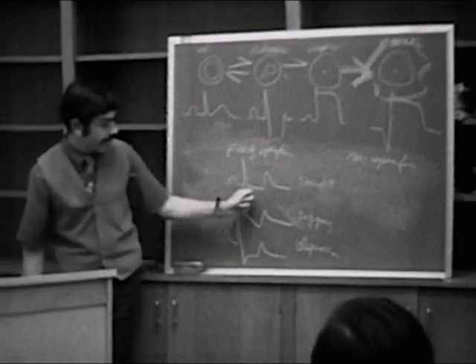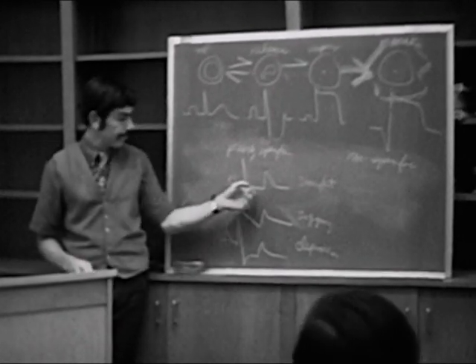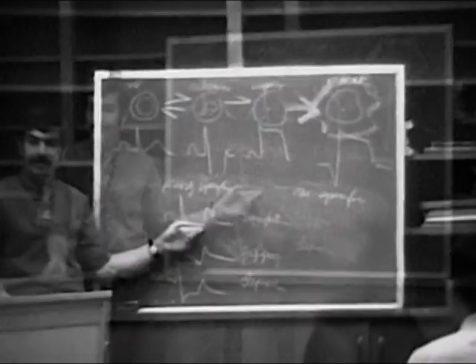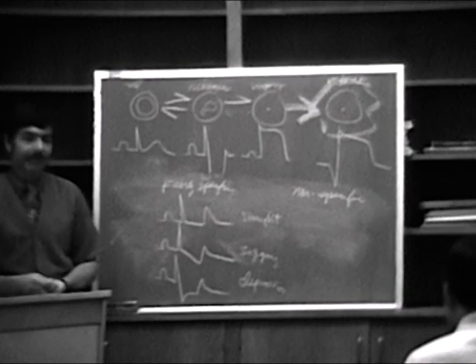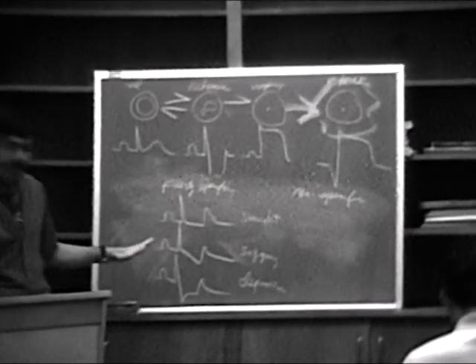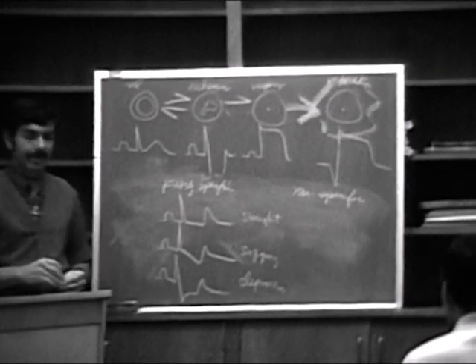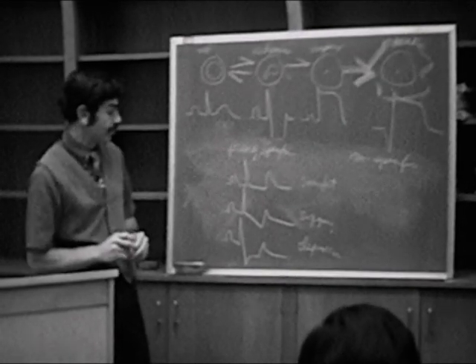Now, in the beginning, before you have much practice in looking at this, you tend to first ignore all of these, and then you tend to overread them all, and finally, after a fair amount of practice, you eventually get to know really what is ischemia, what isn't. So what I'm trying to say really is that it takes a lot of practice and a lot of time looking at a lot of tracings in order to really interpret these things properly, prevent over and under interpretation.